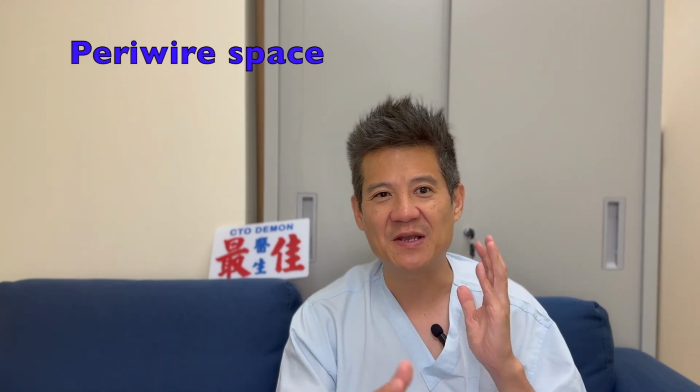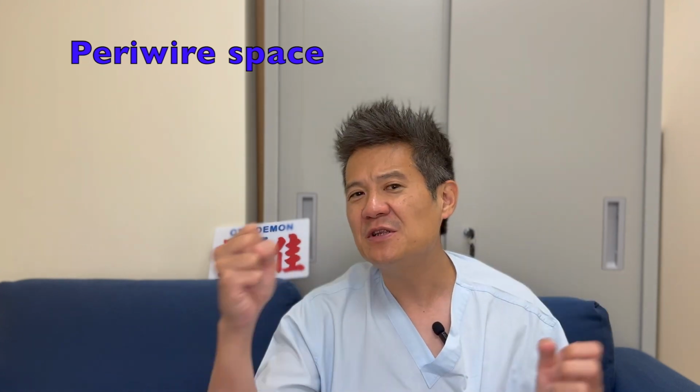Now, the problem with this stepwise method is that usually by the time you fail retrograde single wire crossing, you've created a lot of peri-wire space in the plaque and maybe even some subintimal space that connects with the peri-wire space. So already there's a lot of damage in the plaque near the proximal cap.